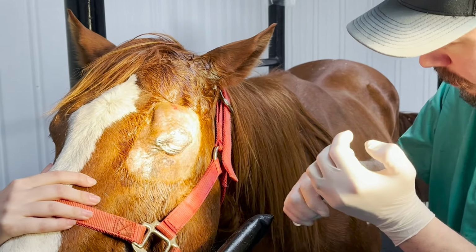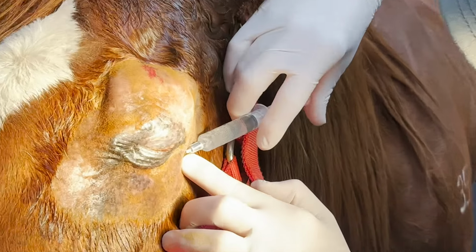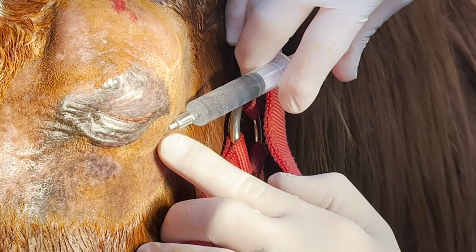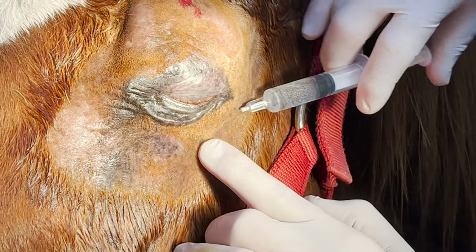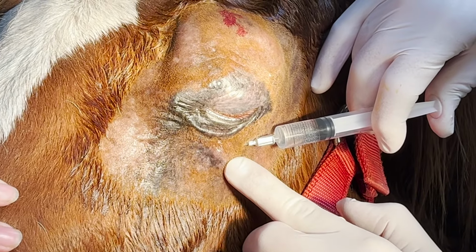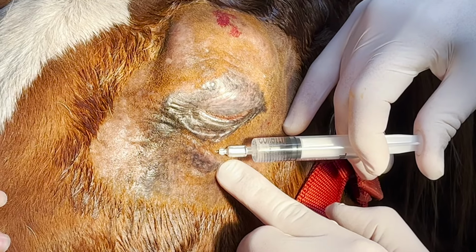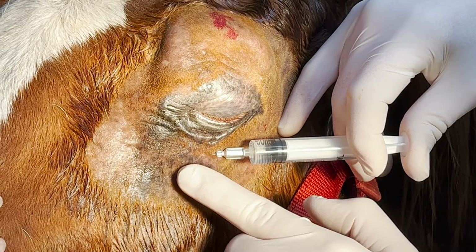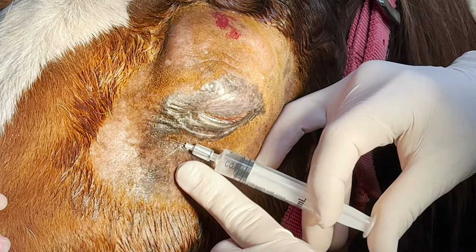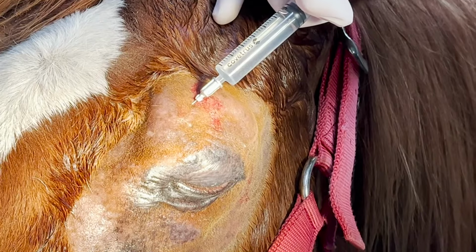And she's sedated. She's got pain meds on board, so she knows we're there, but she can't feel anything at this point with those first few blocks in. And the most challenging nerve to block in these surgeries is the optic nerve. That's the one that comes in from behind the eyeball, and it's almost as big as my pinky in this shot. So getting that numb is very important. It can be very difficult too.